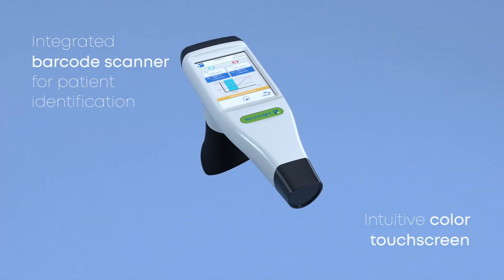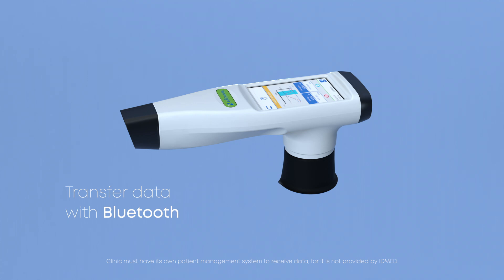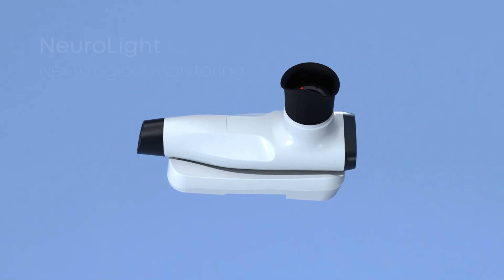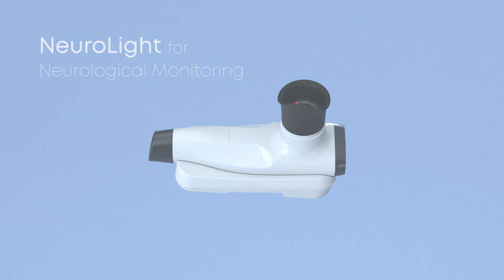NeuroLight comes with a barcode scanner and color touch screen. And if you need to transfer data, NeuroLight can do it wirelessly. It even has a wireless charger. NeuroLight — for neurological monitoring. It's that easy.